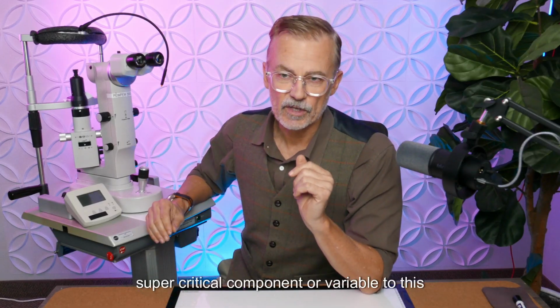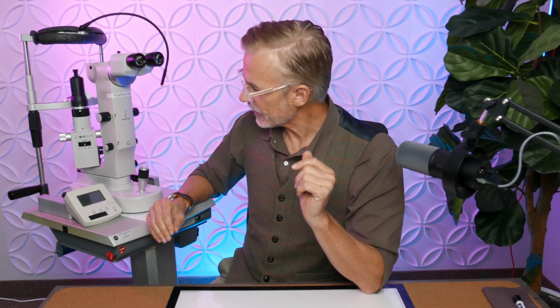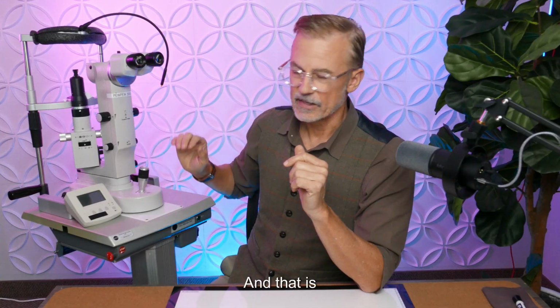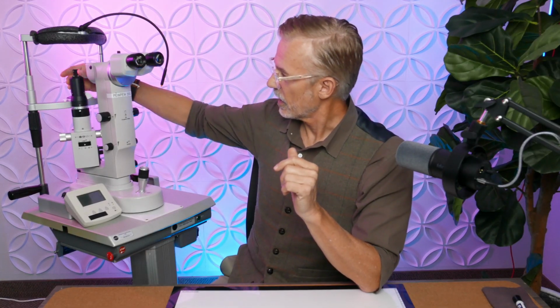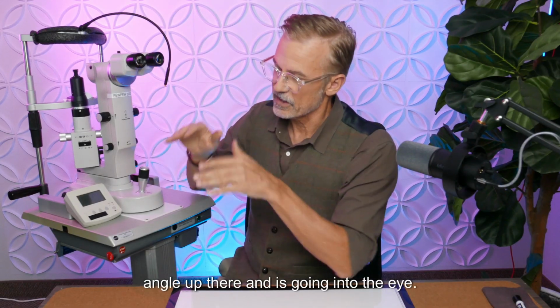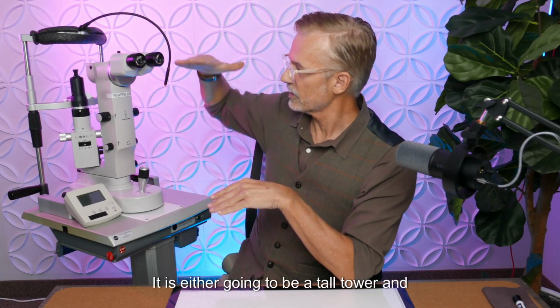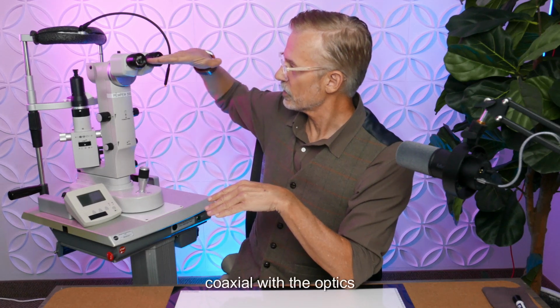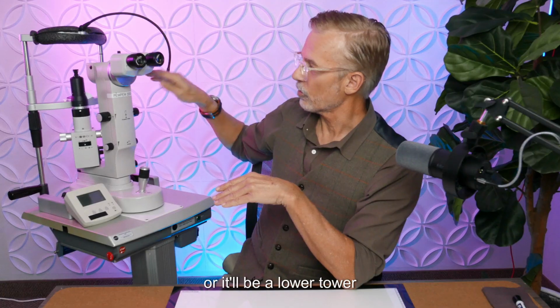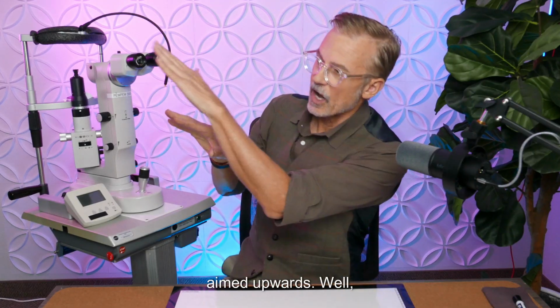Now, one super critical component, or variable, is that the lasers may have either a tall tower or a low tower, and that is the light source that is coming up through this 45-degree angle and going into the eye. It is either going to be a tall tower and it's going to be coaxial with the optics of your eyes here, or it'll be a lower tower aimed upwards.